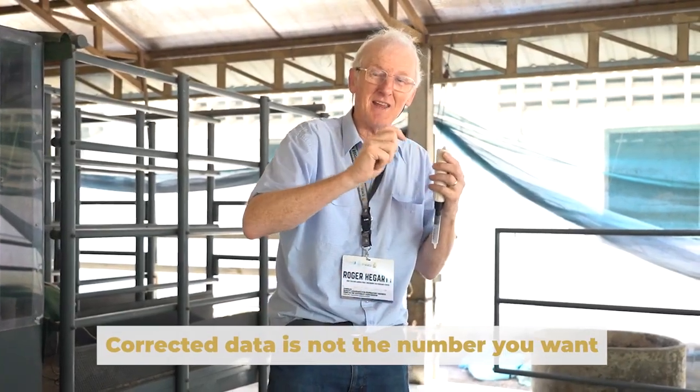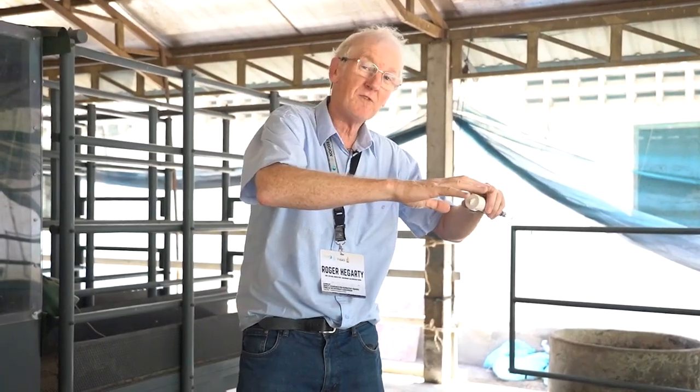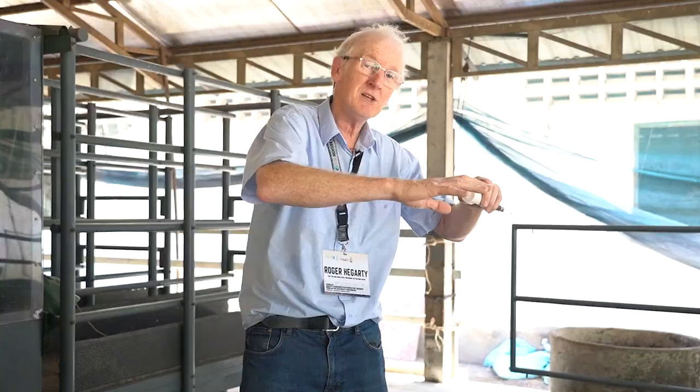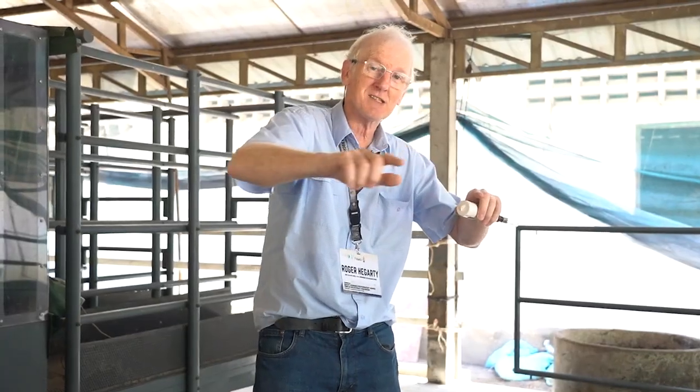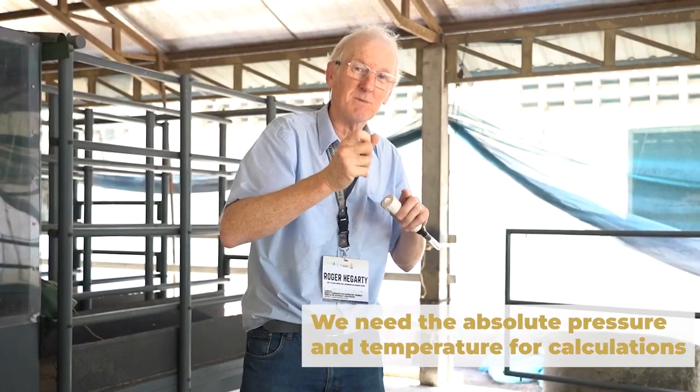If you are going to go to the internet for your pressure, you need to, there's a correction equation that allows for altitude. The Bureau of Meteorology, they bring all the pressures down to what they would be at sea level, which allows them to draw those lovely graphs of high and low pressure moving across the country. But the number they give you is not the absolute pressure.